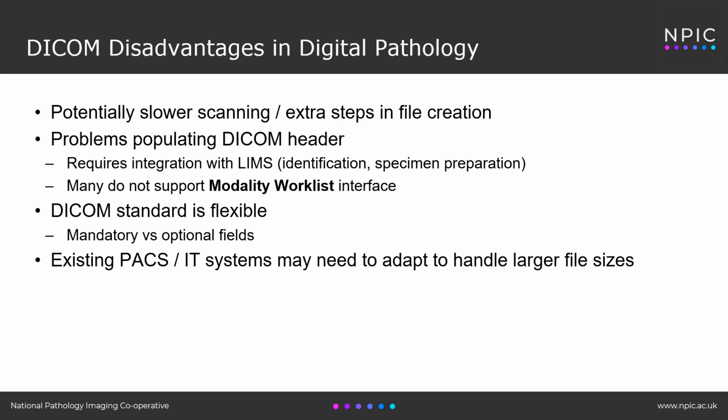And obviously there may also be disadvantages. It has been reported that there's potentially slower scanning to DICOM. Obviously this depends on individual scanners themselves and how they handle the format, or extra steps in file creation, such that if a scanner doesn't natively output DICOM, that extra step may be required in converting the proprietary file to DICOM.